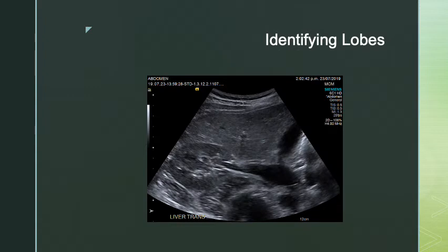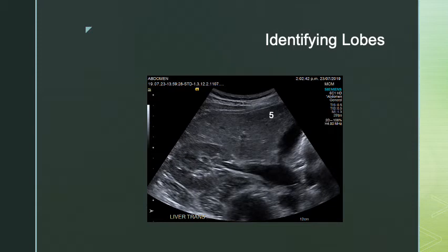Here we have a transverse image of the inferior right liver. Based on the kidney and the shape of the liver, with right, left, anterior, posterior orientation — my right liver is divided into anterior and posterior, and at this inferior portion I'm looking at segments five and six. Segment six is more posterior, closer to the kidney, and segment five is more anterior.